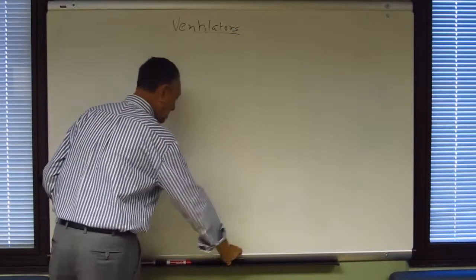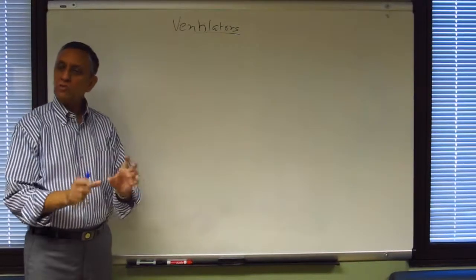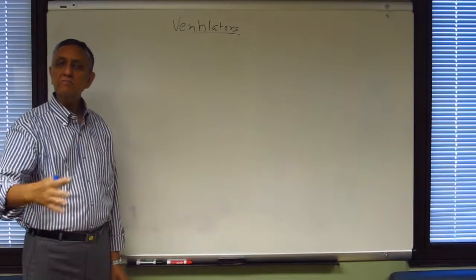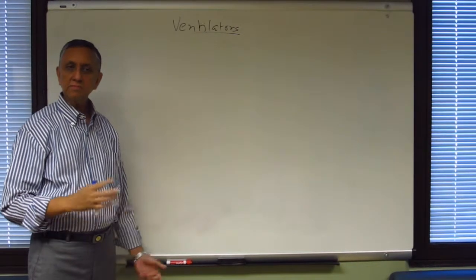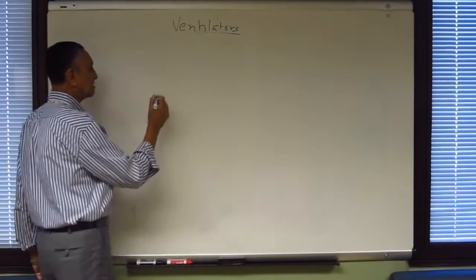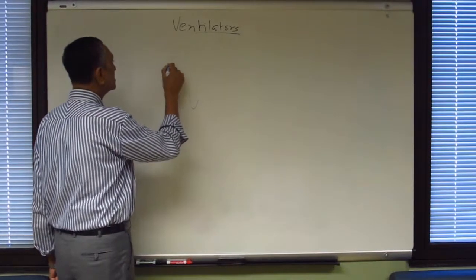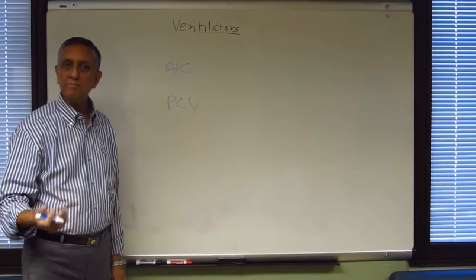Okay. Now I want you to list all different modes of ventilator, starting from the oldest mode, and then we will talk about each of them. What happened from iron lung? Which one came about? What is it called? Different modes of ventilator. Pressure control. Sure, pressure control is somewhere in the bottom, but yes, pressure control ventilation. Assist control. Assist control, yes. Volume control. Volume control is the most common one, so we won't list it, but that's one of them.